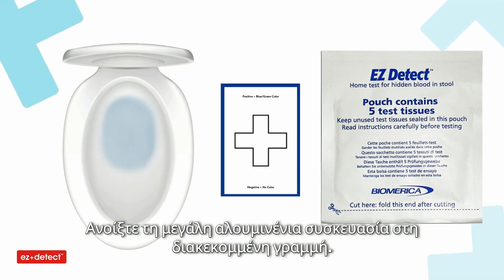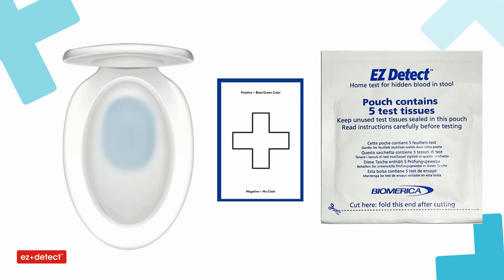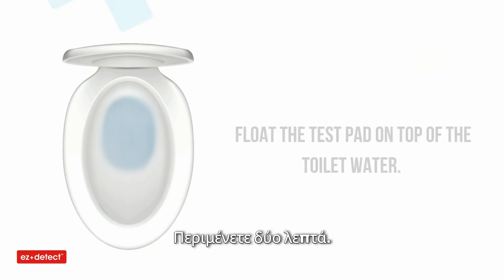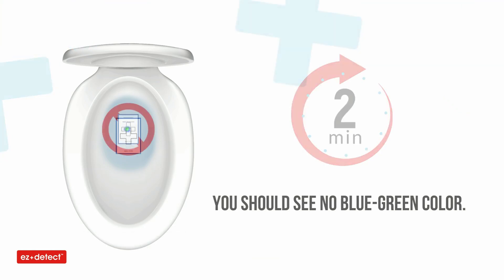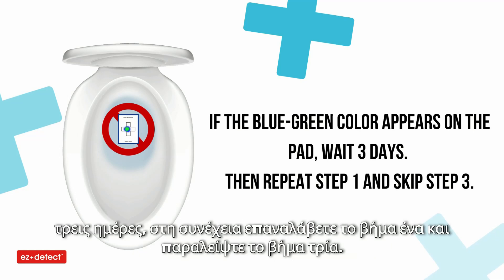Cut open the large pouch at the dotted line and take one test pad out of the pouch. Float the test pad on top of the water and wait two minutes. You should see no blue-green color. If the blue-green color appears on the pad, wait three days, then repeat step one and skip step three.